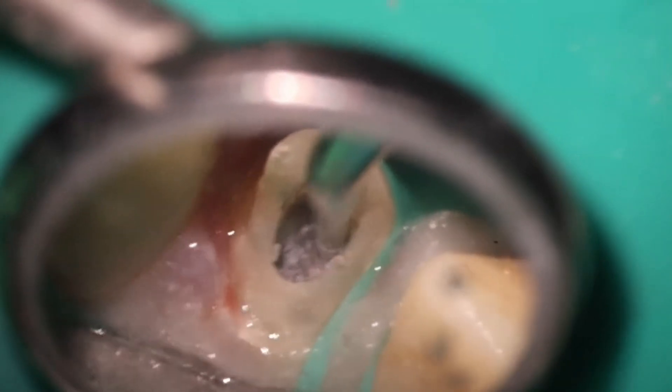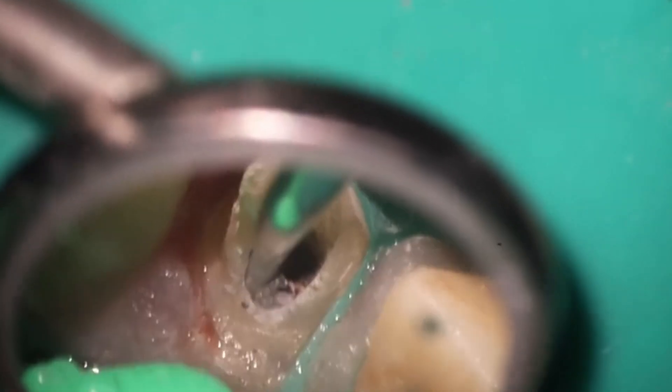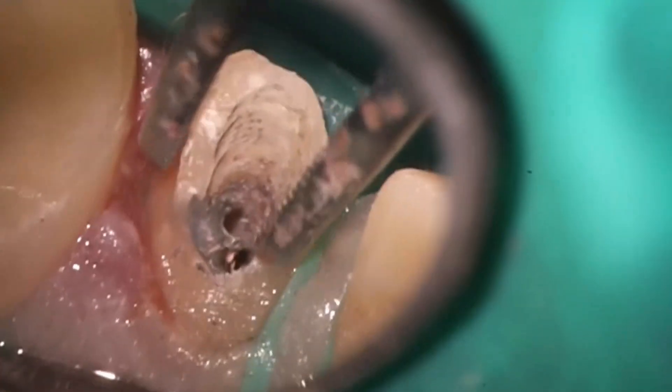Sometimes getting in with a carbide and spinning it around can actually snap it loose a little bit, and it's definitely starting to get mobility here. The other thing you can do if you have a large post — or in this case a post drill — you can actually make the post smaller by drilling around the outside if it's not moving. You can see I'm getting a fair amount of movement. Usually with these I have to back them out, but in this case I was actually spinning it almost as though it was engaging in a clockwise direction, and it popped up very readily. So don't hesitate to try moving in an opposite direction. You can see the two pieces of the post drill — patient wanted it, so I gave it to her in a little sterile bag.